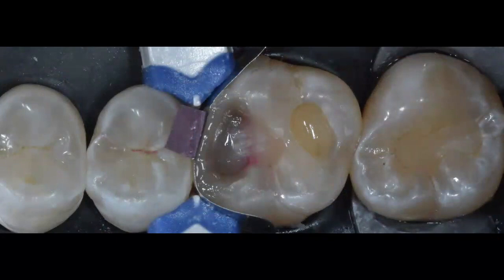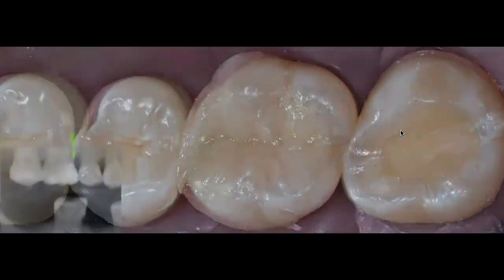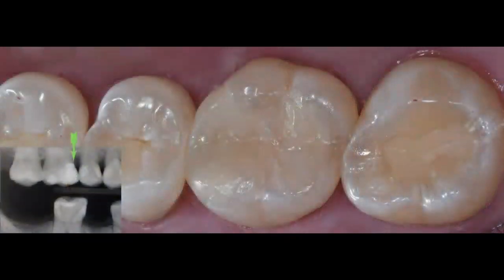I think that the Garrison ring is definitely my number one, and I'm still using the 3D Fusion, but this is definitely my number one matrix system to use for any class 2. And once I have completed my final enamel layer on that restoration, I remove the band, I finish, I polish my restoration, I adjust the occlusion, and you can see right here on my bite wing, that deep margin elevation and that new proximal wall, how they're both bio-integrated.